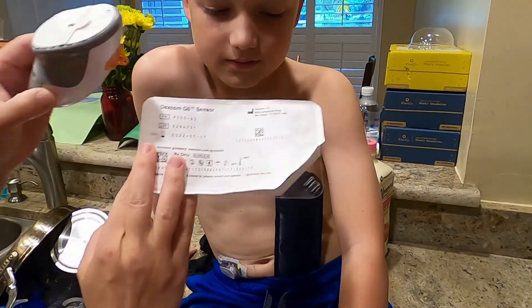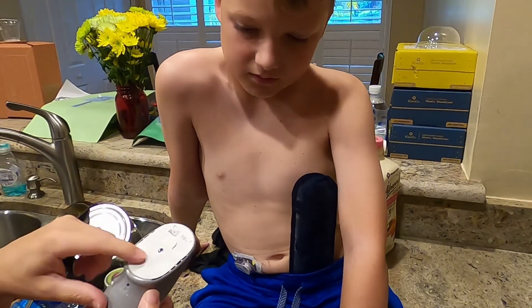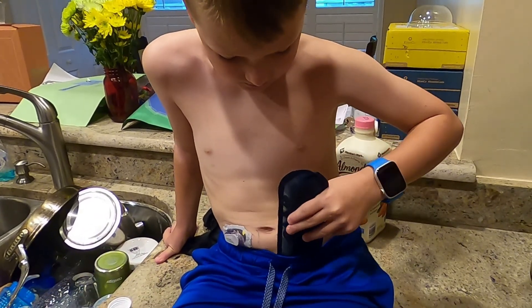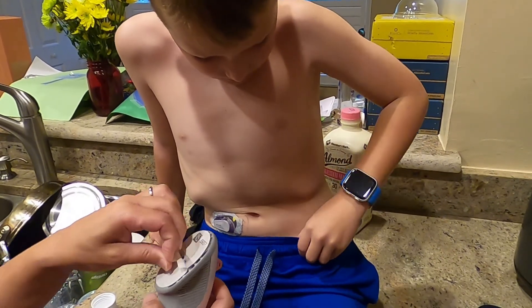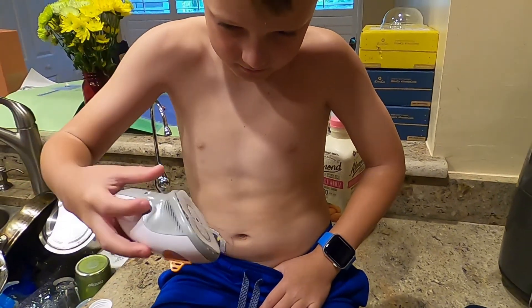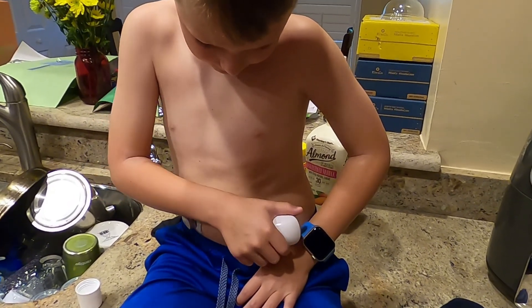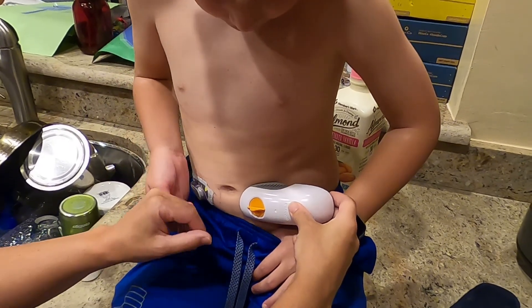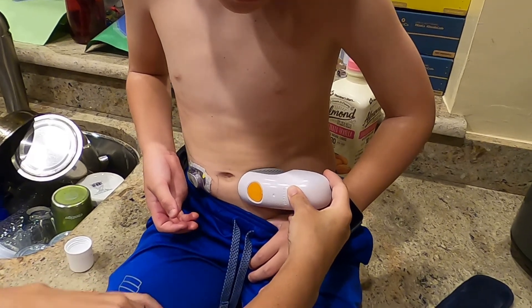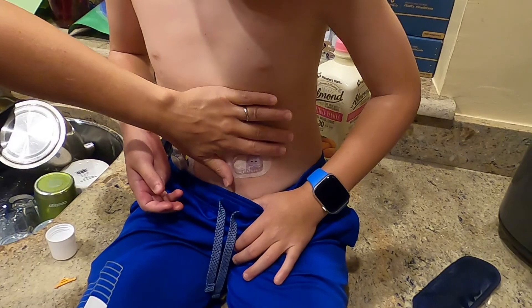So we've already taken it out of the little box. I'm going to wait until Abel says that he's ready and then I'll take the backing off. And Abel likes to place it, so you put it wherever you want it. Let's make sure your skin's all dry though. Then you just break off this tab — just break it and now it's ready to go. Abel, you tell me when you're ready. You just push the button.